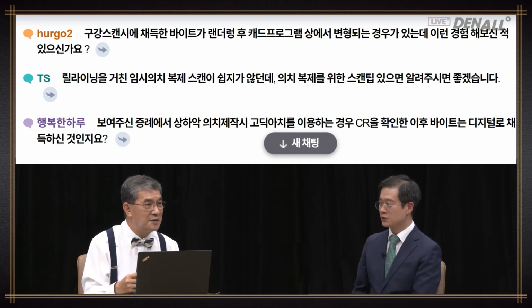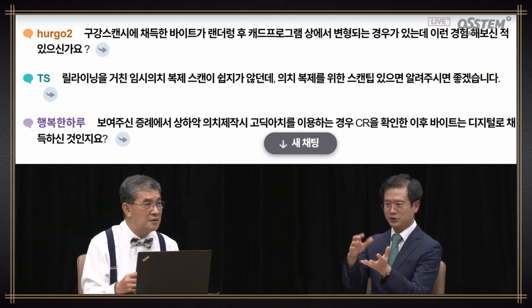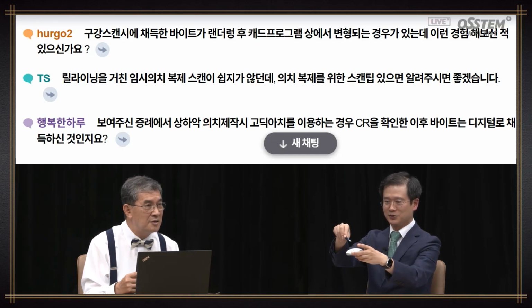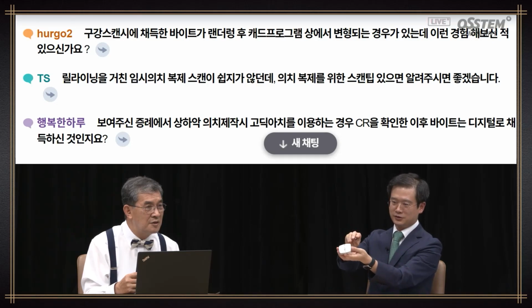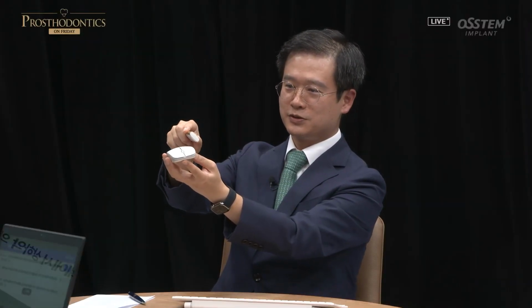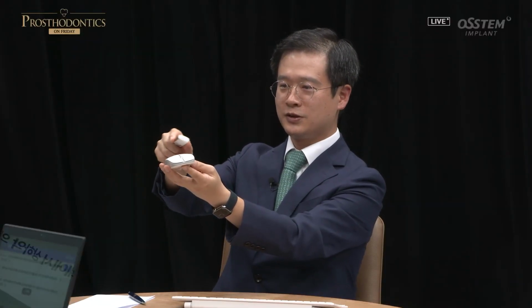These days, for dentures which have gone through relining, I use an oral scanner to replicate them. When you go from the front side to the back side, it is the same here. If it is the tray rim, you should not just carelessly do it, but pay more attention to it. You need to go from the inner surface, from the rim to the outer surface, sideways carefully. If you use this kind of motion, the oral scanner can be used for denture scanning.